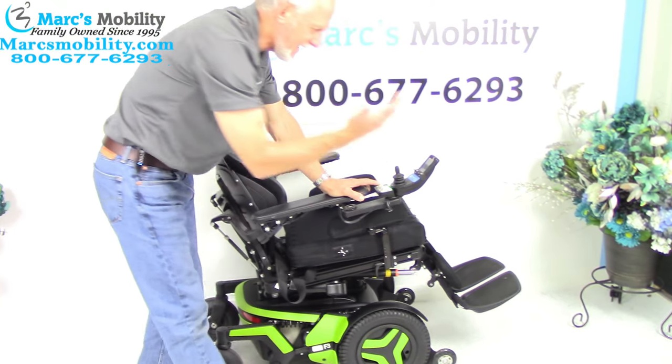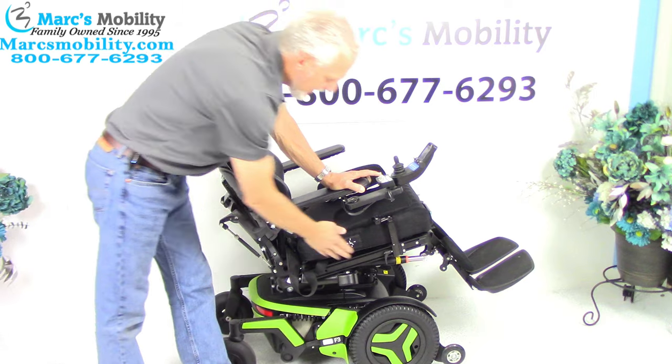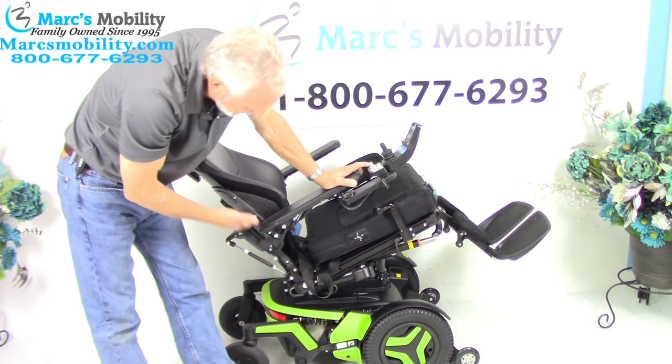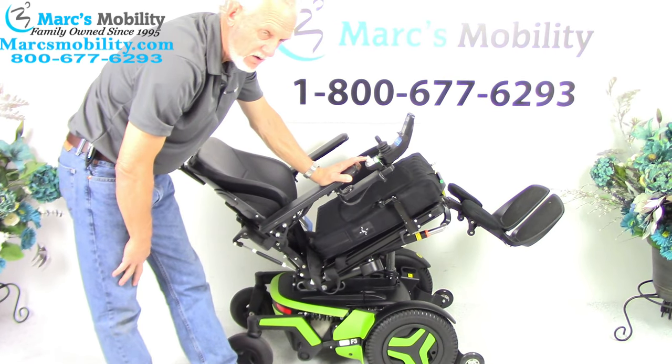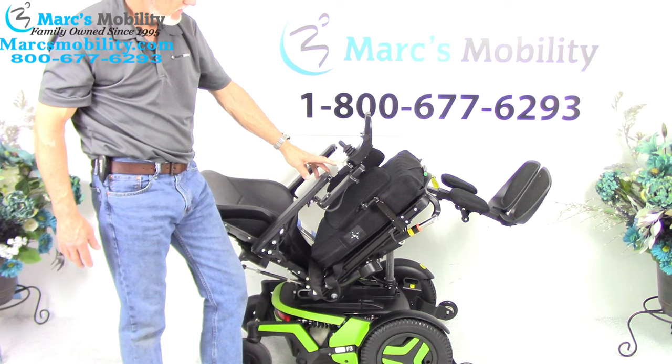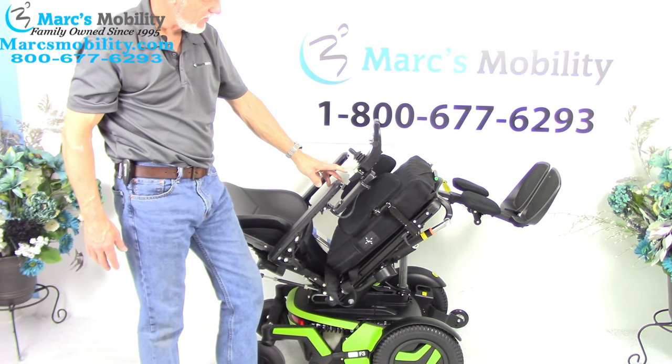When the bottom here goes back, it'll take the legs and it'll take the back because they're both connected together. This is called the electric tilt. This is as far as it'll go.